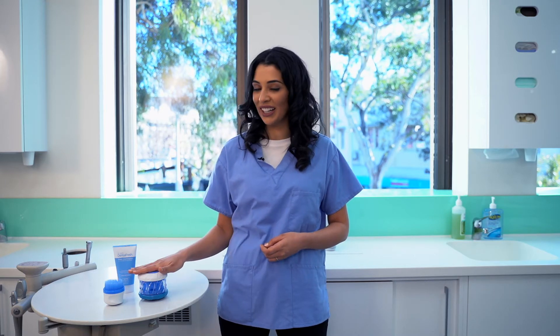Your orthodontic retainer is in and out of your mouth all day long, so it's really important to keep it clean. Let me show you how to clean your retainer in under a minute with Dr. Mark's Hygiene.